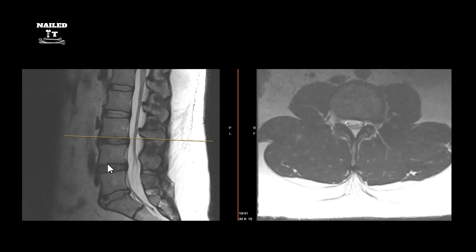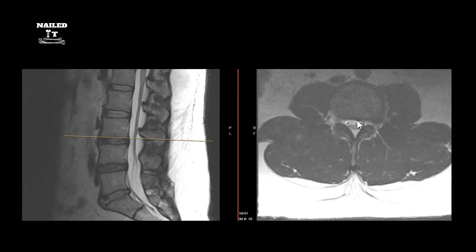At this level — L3-4 — if this is the exiting nerve, I would expect this to cause symptoms in the left-sided L3 nerve distribution. Far lateral and extraforaminal disc herniations tend to injure the exiting nerve root. If the pathology were more in the lateral recess or central canal, it would cause symptoms in the traversing nerve root instead.